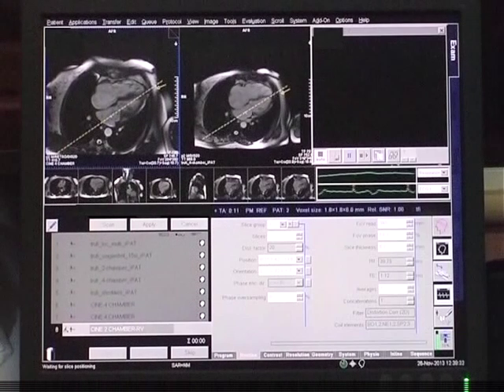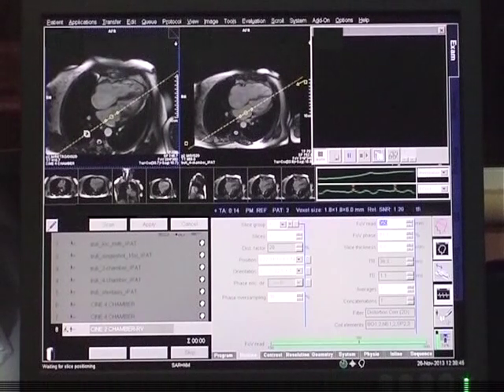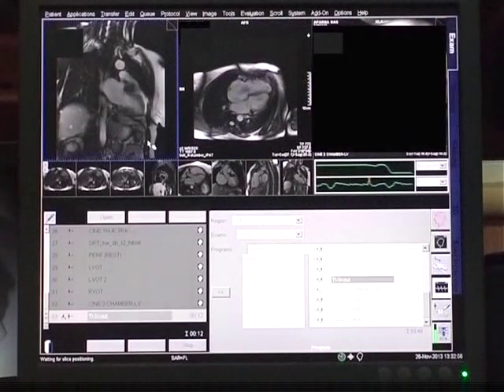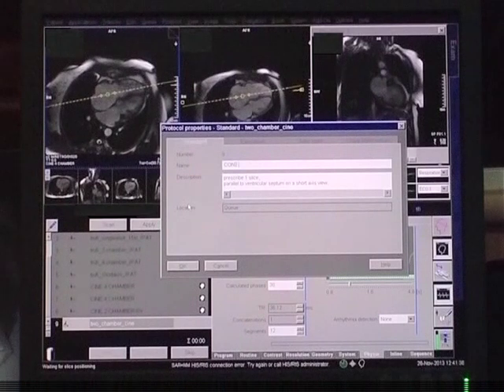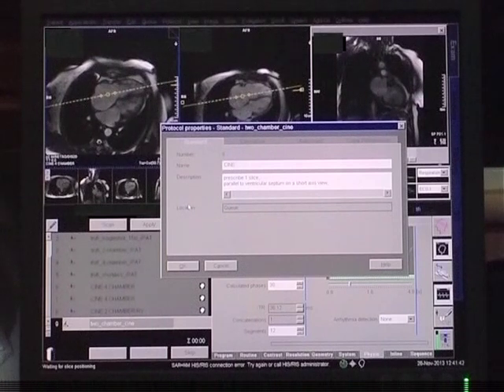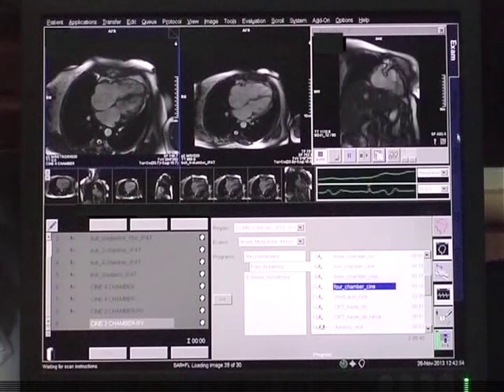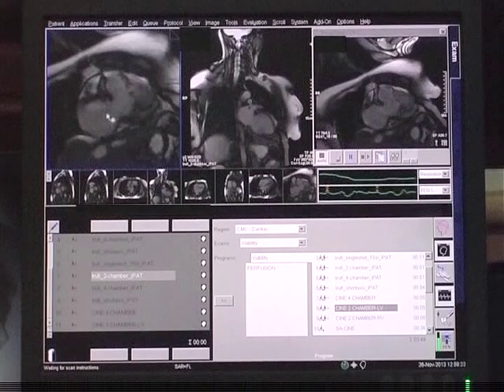A true two-chamber view is planned on the true four-chamber view by drawing a line through the left atrium, mitral valve, and the LV apex. Since the pathology is on the right side of the heart, a true two-chamber view of the right side is obtained by drawing a line through the RA, tricuspid valve, and RV apex. This shows the right atrium, the right ventricle, and RVOT.